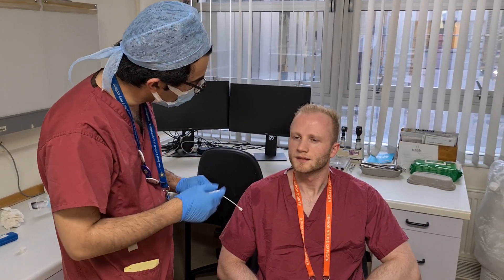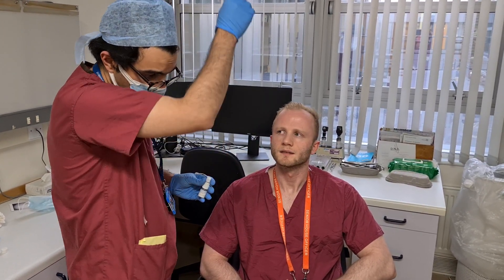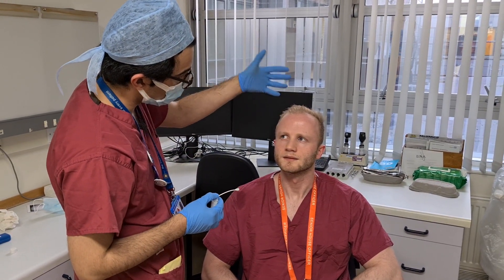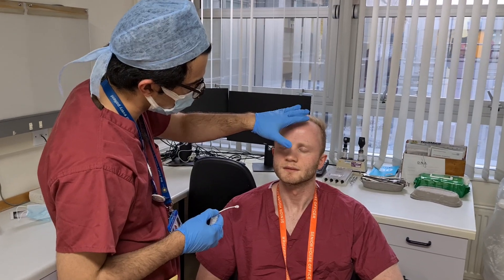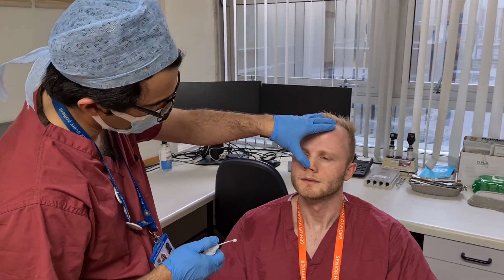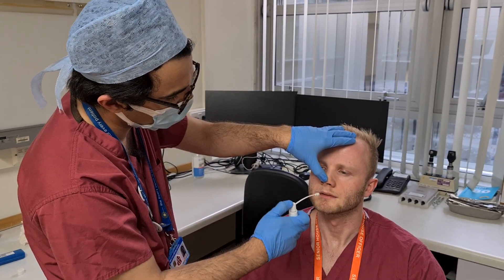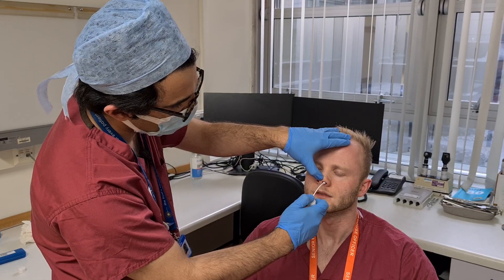How are you breathing through your nose? Do you have any difficulty breathing through one side or the other? Sometimes a bit blocked on the right side. Is it blocked today? Feels okay today. Can you take a nice deep breath through your nose? That's all nice and open. I'm just going to spray this solution into your nose — forgive me, it doesn't taste very nice — just making sure that this procedure is easier for you. I place my hand on the patient's head and lift the tip of the nose so you can see the entry of the nose on each side, then spray some of the solution on both sides.